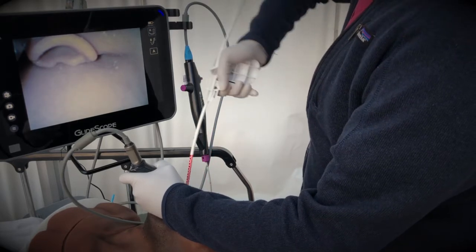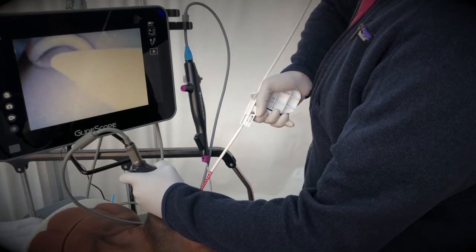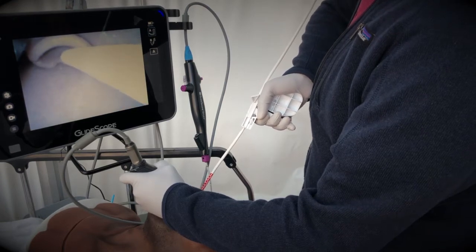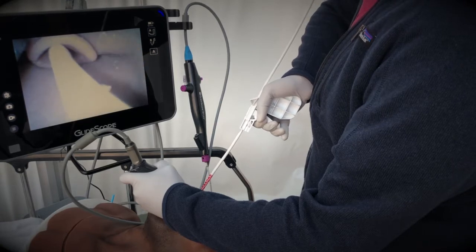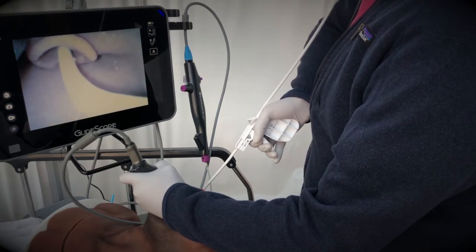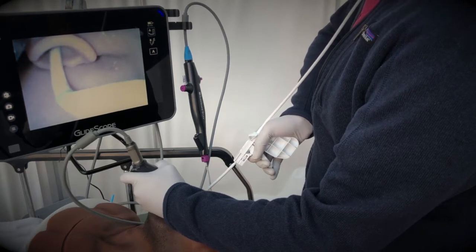and once you're in the hypopharynx let go of the trigger so that the tip takes on its natural curve, at which point you can then advance the tip past the glottic opening.